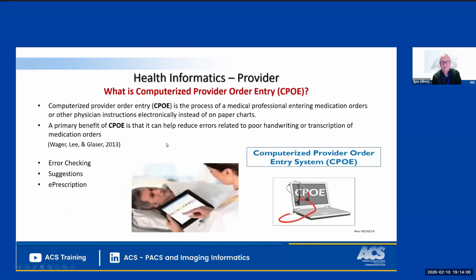Of course, I'm going to take a lot longer describing all of those things, but the network is extremely important, and that is actually probably a lot of the test that you're going to take. So we're going to look at how the providers work. They're going to use their own computer. With the Affordable Care Act and the regulations that came in the last 10 years, it now requires the physician to do their own ordering through their own computer. And we're going to talk about that workflow and how we can reduce poor handwriting and basically medical errors because the physician is now in the front. But we made it easy for them. We'll just talk about that.